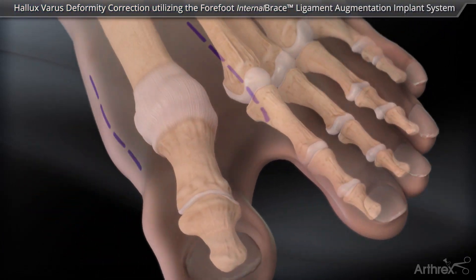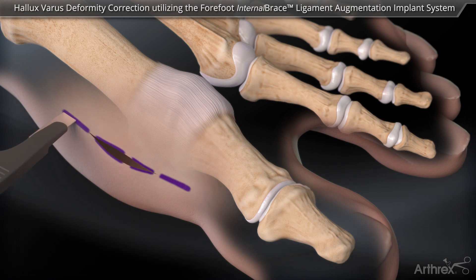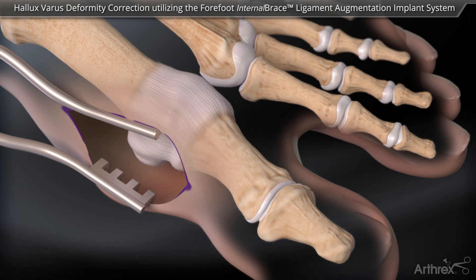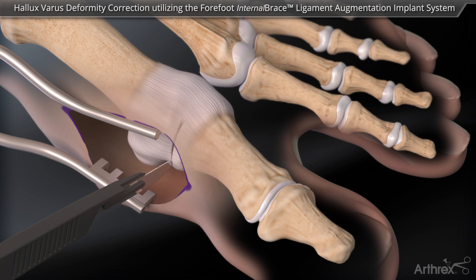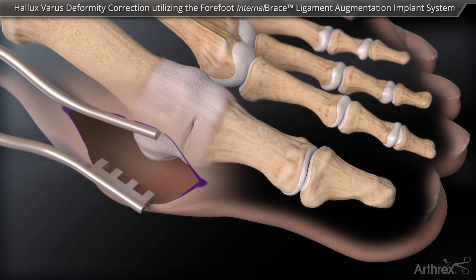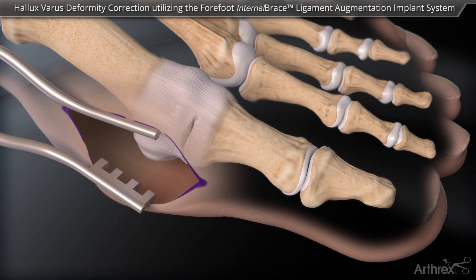An incision is made over the medial aspect of the first metatarsophalangeal joint. The incision should be long enough to visualize the metadiaphyseal junction of the first metatarsal and the proximal phalanx. A vertical incision is made over the first MTP joint to release the contracted medial tissues. The capsule between the medial sesamoid and the metatarsal head may also need to be removed or released to mobilize the medial sesamoid.